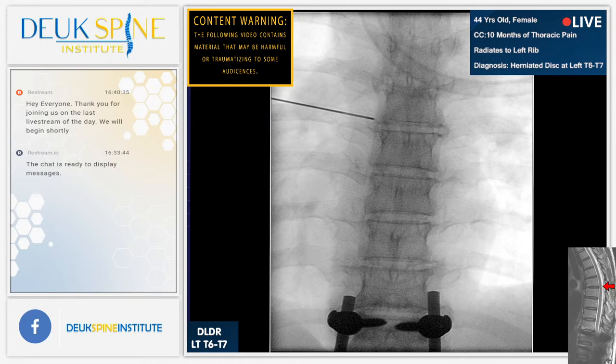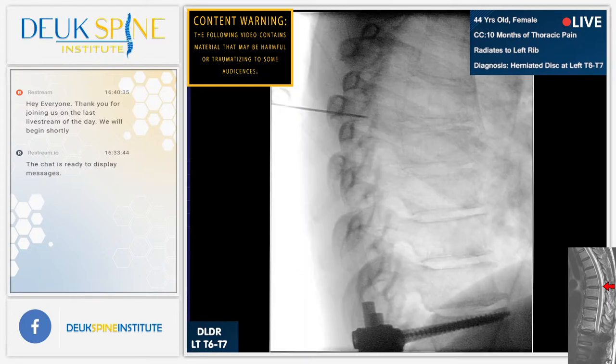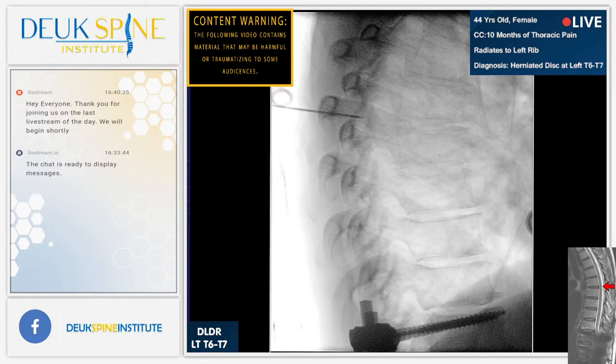So when we go to a lateral view, you'll see what I'm doing is placing a needle. That needle is going to go from the back through the neuroforamen. 11, 10, 9, 8, 7, 6, 6, 7. Try to line those end plates up. So what I'm hitting, folks, is the facet joint. A little bit of orbit the other way.